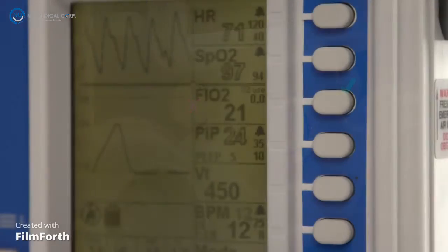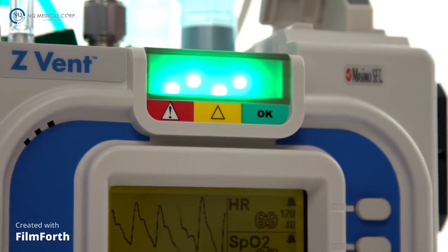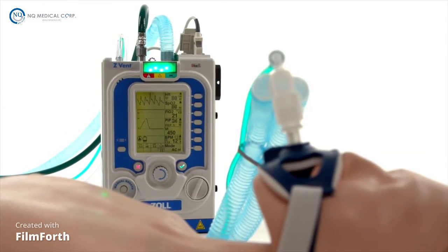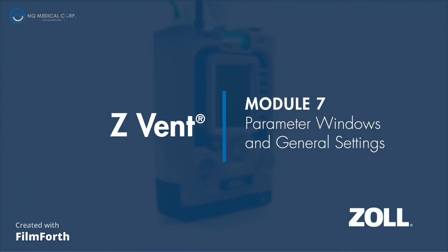Hello and welcome to the ZOLL Z-Vent in-service demonstration. This multiple-part series will provide detailed information about the Z-Vent portable critical care ventilator and its functionality. In this module, we will review the parameter settings and their unique context menus.